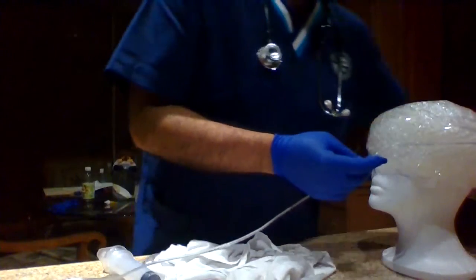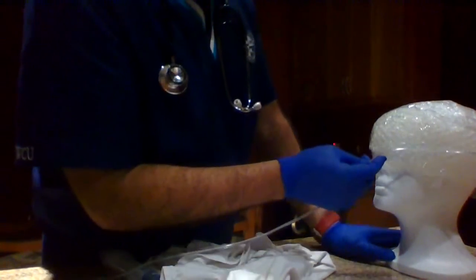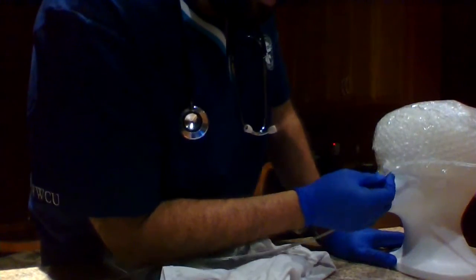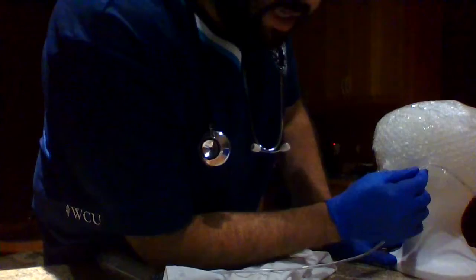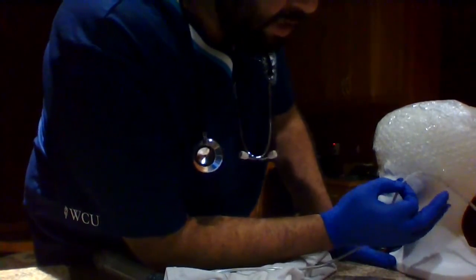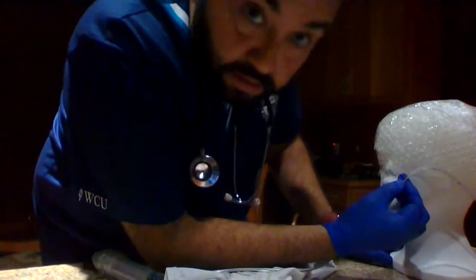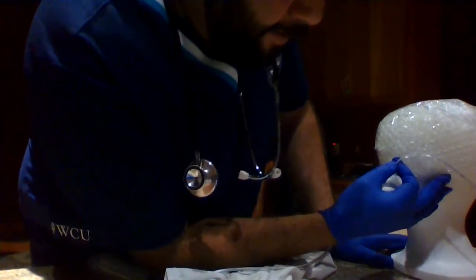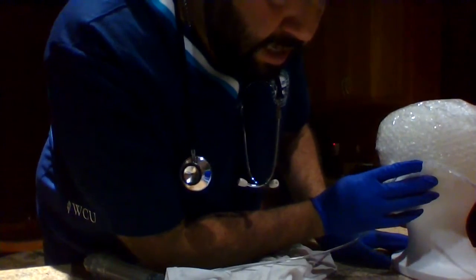We take it away. We again watch for the hand signal. You ask them about comfort, ask them how they're doing. Any signs of respiratory distress is your big indicator to pull back the tube immediately. Watch for facial grimacing. So now we have the tube in place.